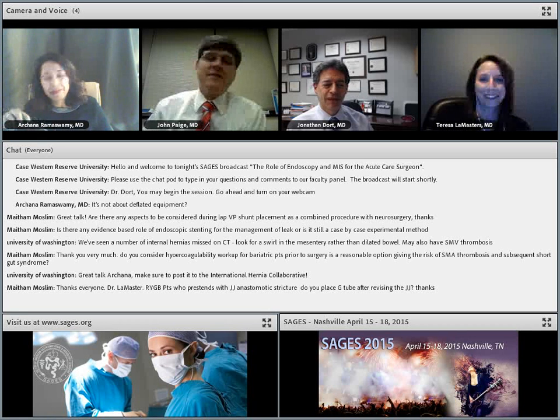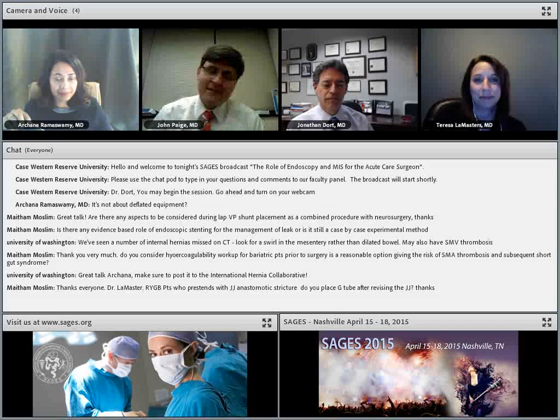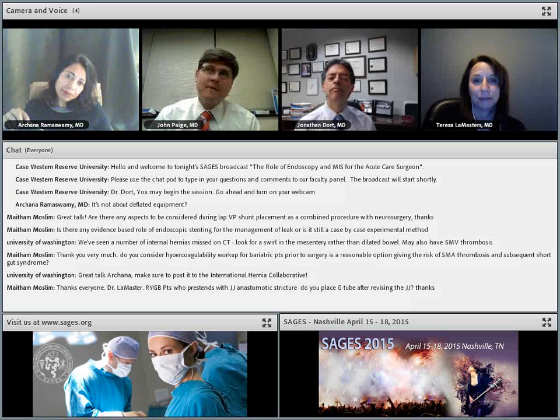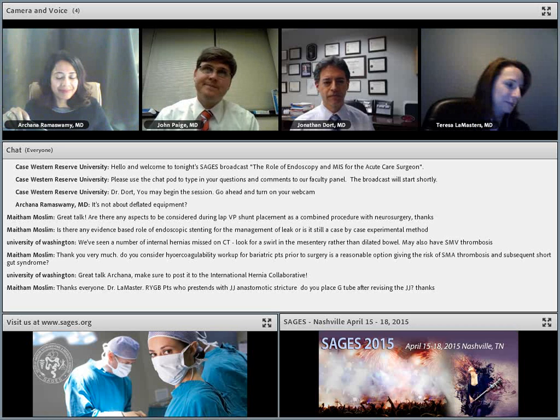I think in bariatrics, initially at least, you've got a huge apron of fat there, and if you're high up there, that's why I think some people don't. In the skinnier population, I've had Richters from closing. I closed a left lower quadrant port for an appy, and ended up getting a Richter's on it.